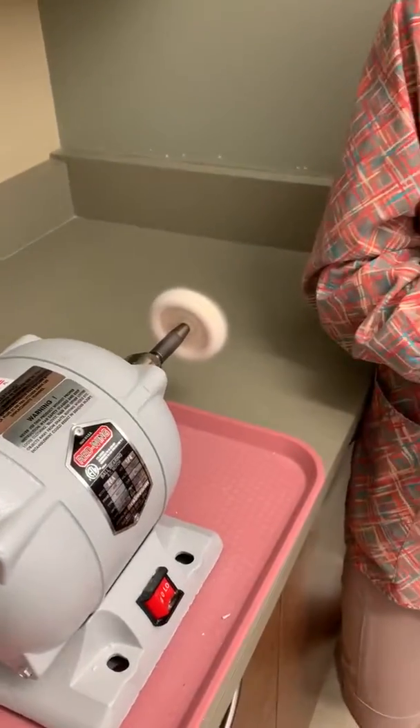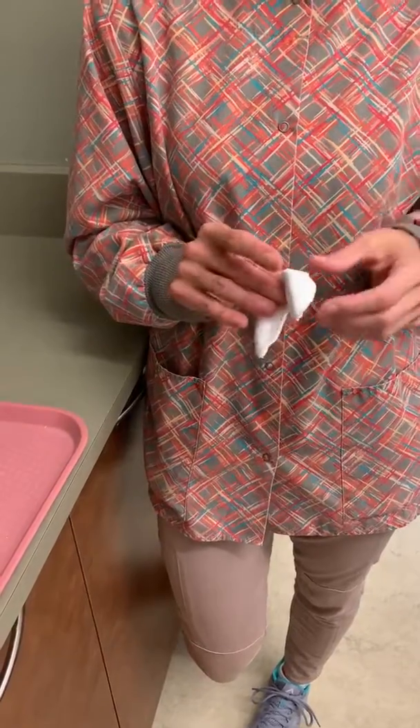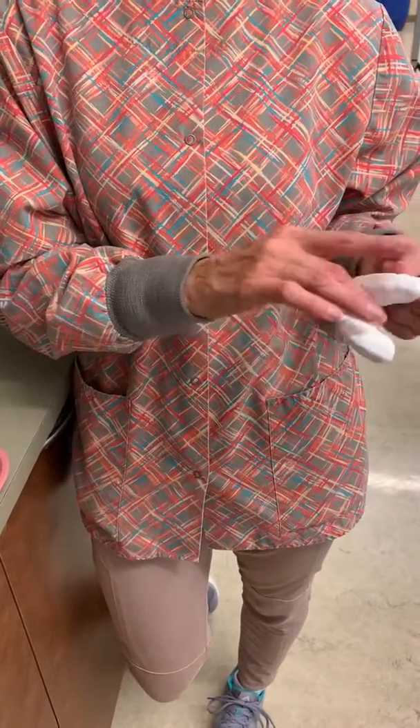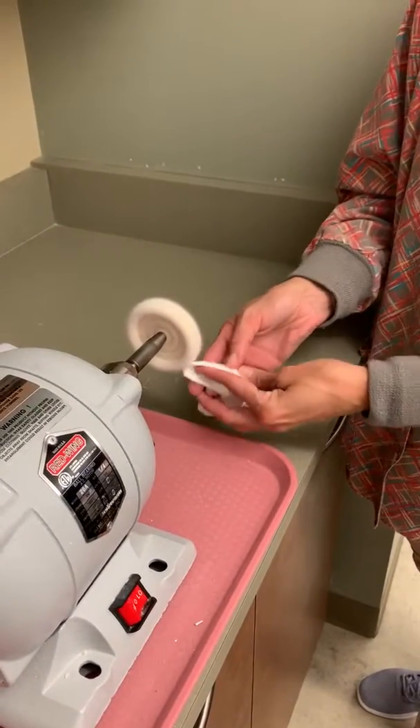What you want to do is of course have your PPEs on — glasses, mask. You don't need gloves, and you want to put some pressure in the area in which you're going to be working because it's very clumsy, and you just want to press it against the wheel.